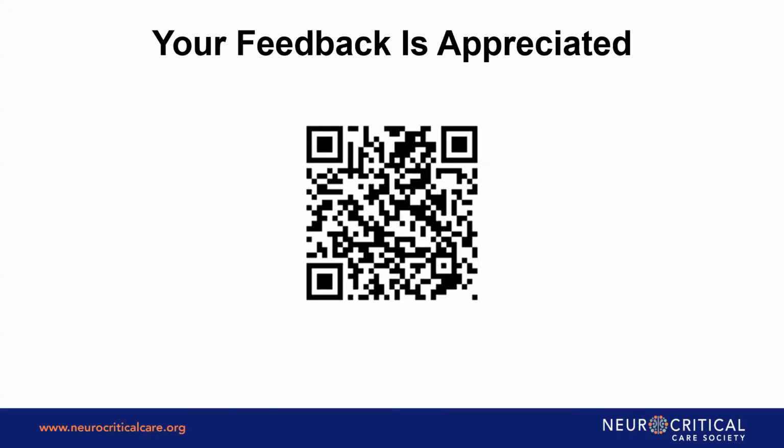But I would say that the recorder's battery is never to me an issue. I have more issues with degradation over a few hours of the quality of the signal because the patients are moving and/or the leads are moving on the scalp, and obviously, a restless patient will degrade the study even within 30 minutes, or even rip off the headband before the battery comes to an issue.